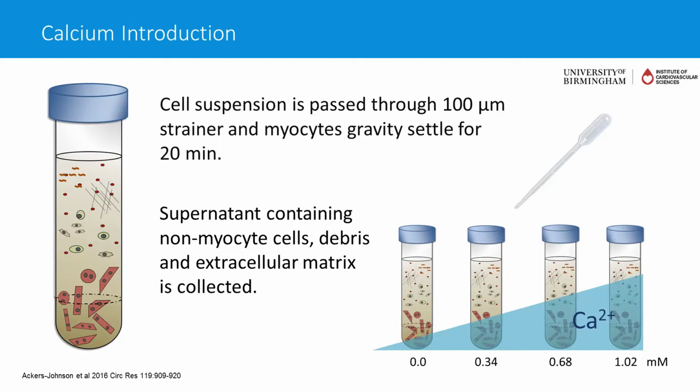So I guess we're putting ourselves more at risk of a hypoxic pellet then, maybe. Otherwise, what we find is a lot of our cells settle on the rim, on the slopes of the 50 mil Falcon tube, and when you're aspirating or whatever you do to take away the supernatant, you can lose some cells that way.